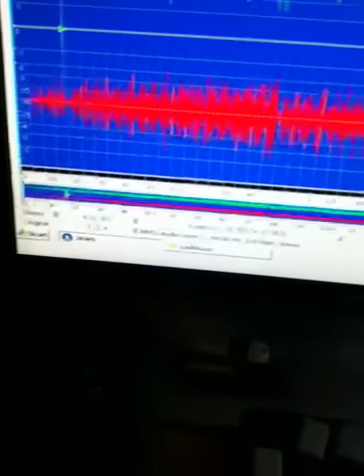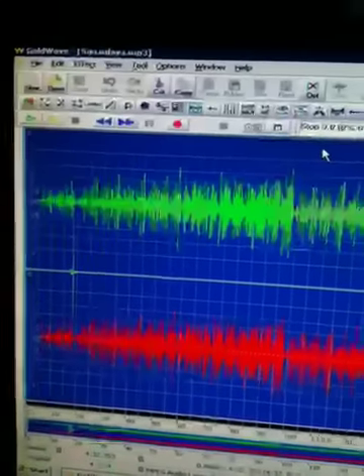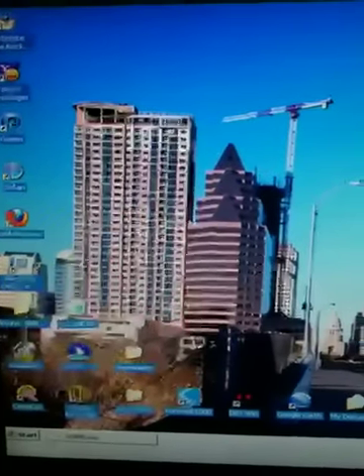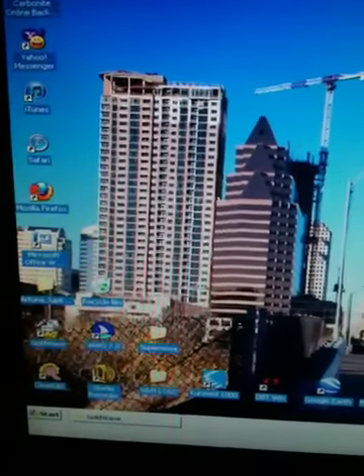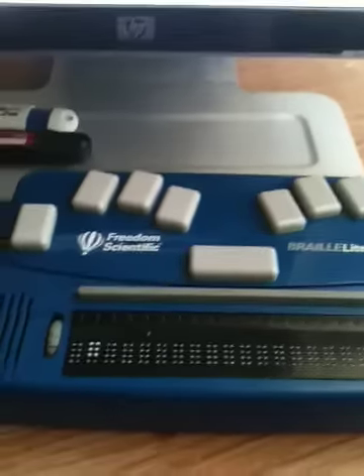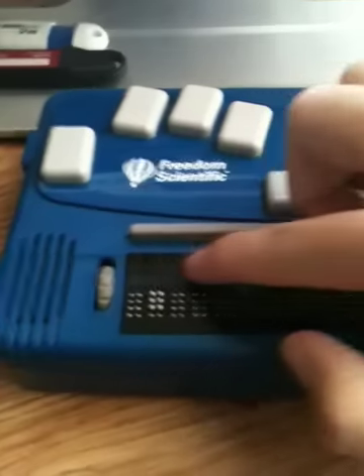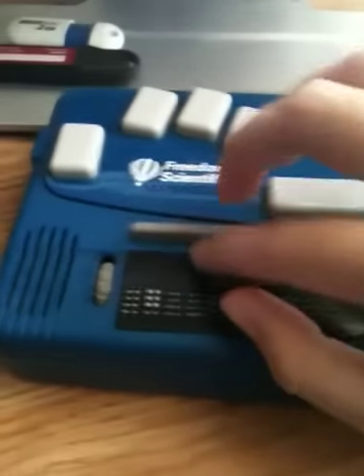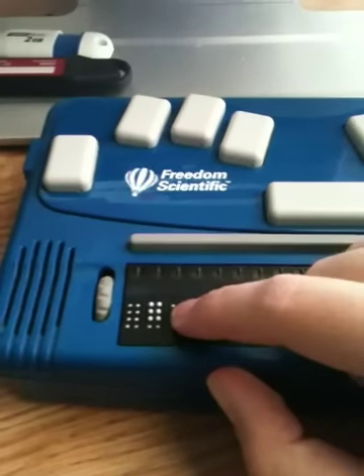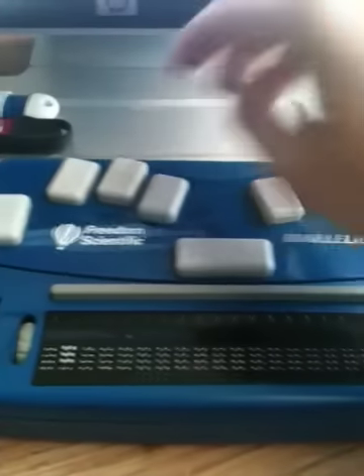And I'm actually going to show you one more program. So that tells me to hit the space bar to select certain things. I'm going to open up Supernova real quick, hopefully without taking forever. While that loads up, I'll go back to here. Like in the other video, I was explaining a little bit about Braille. This might make a little more sense now that you can actually see what they call a Braille cell. Each one of these are its own cell, and there's 32 on this machine. So right here I typed in all six dots — dot 1, 2, 3, 4, 5, and 6 together. This combination, which they call a chord, just like you would on a piano. That one's talking now.